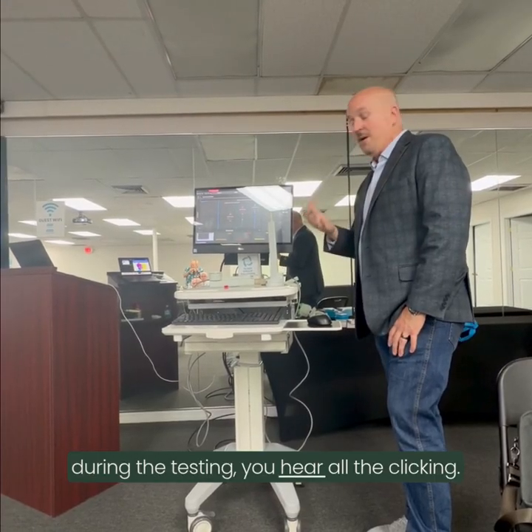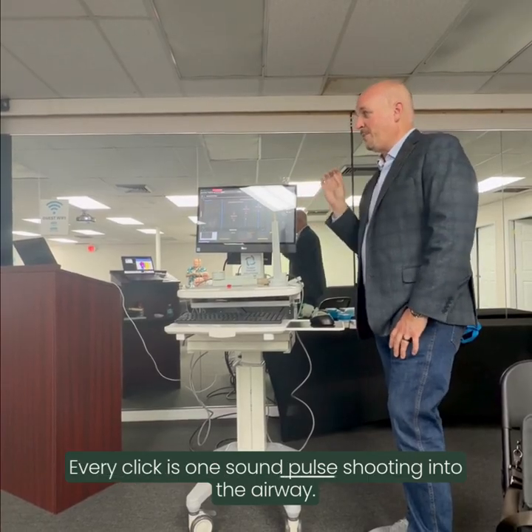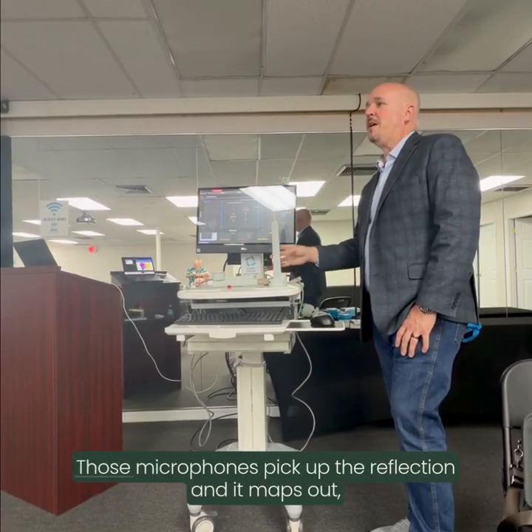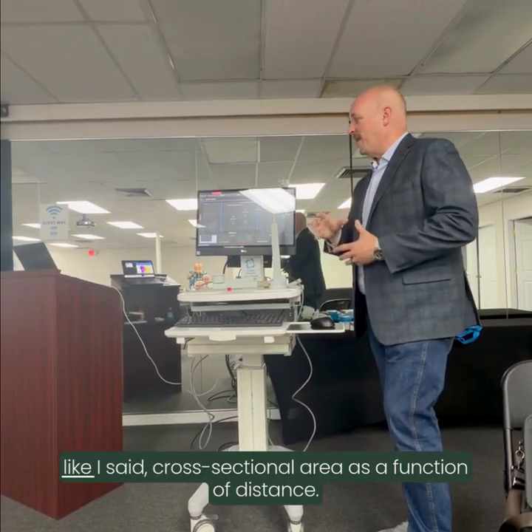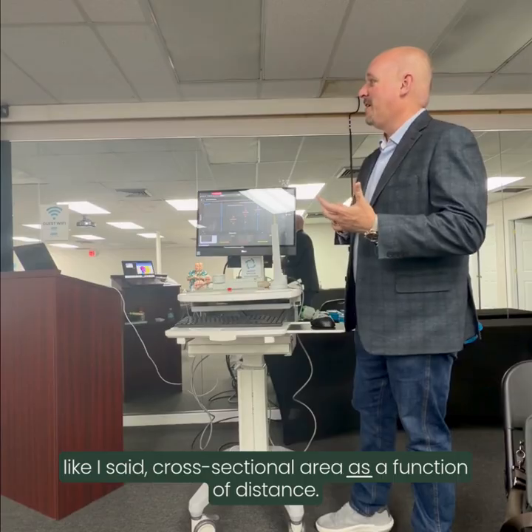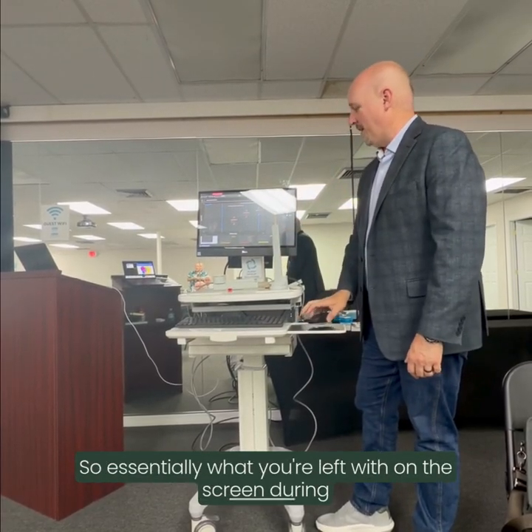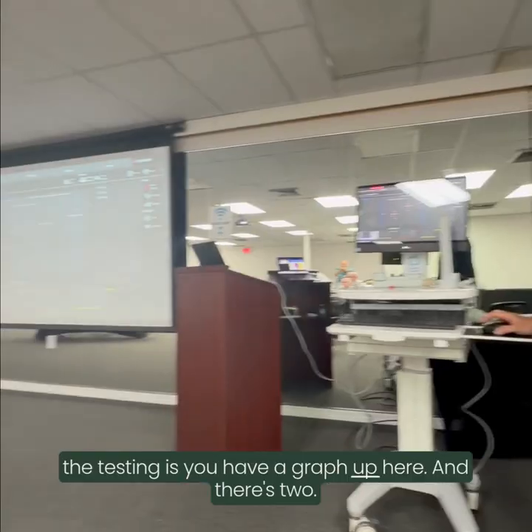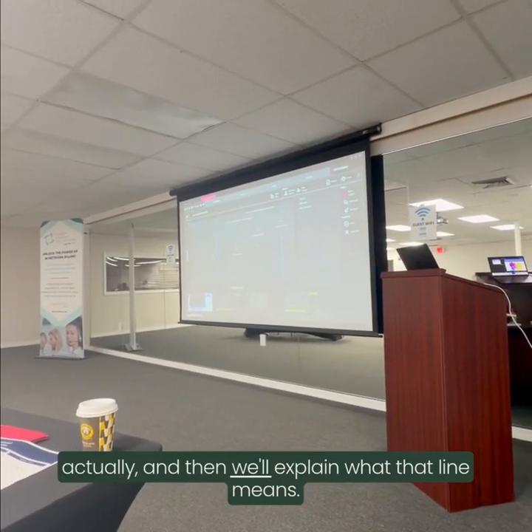During the testing, you hear all the clicking. The clicking is sound waves. Every click is one sound pulse shooting into the airway. It reflects out. There's microphones in the tube. Those microphones pick up the reflection, and it maps out, like I said, cross-sectional area as a function of distance. So essentially what you're left with on the screen during the testing is a graph up here, and there'll be a line on it.